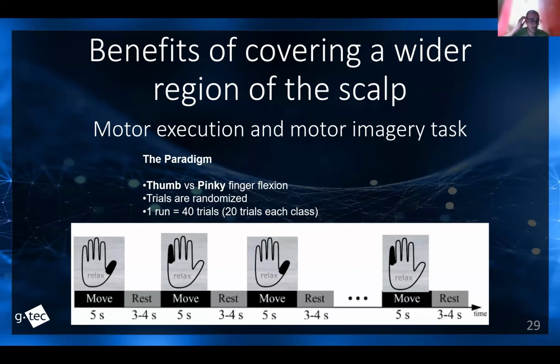The idea was to lift the thumb finger and the pinky finger, to discriminate the differences between the lifting of these 2 fingers. In front of the subject, there was always an avatar that was emulating the real task. So the idea was to do an online classification to get the results and then a prediction from the avatar.